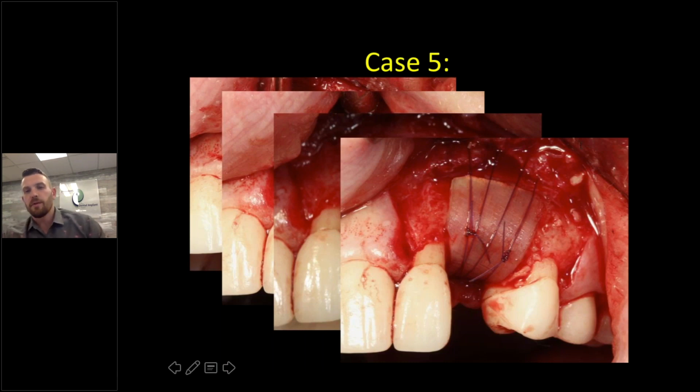Are you able to wrap the bone membrane from lingual to buccal without it springing back? No, you cannot. So again, that's kind of when I had said there's some cons to this. You need to make sure that you know where you're going to fixate it and how, and there's some technique to it. So really, when I'm doing this, I have my assistant hold the membrane in place, and I sometimes will even, I'll go back to sharing this case. In this situation, I will actually prep the sling suture and lay it off to the side.